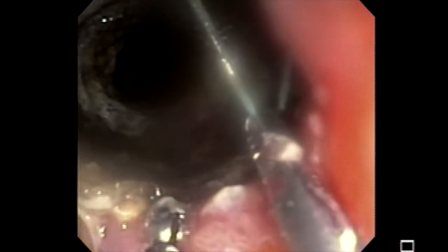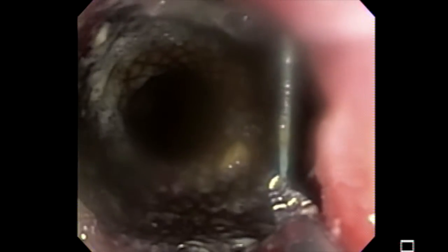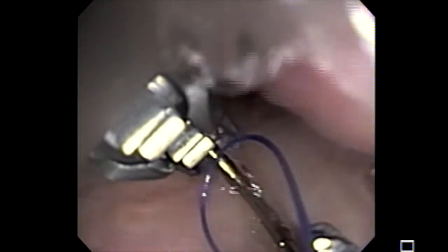I'm trying right now to pull the stent up with Raptor, and it's not working, so I'm going to add a biopsy forceps to the other side. We're using a dual-channel endoscope, and by having a Raptor with biopsy forceps at the same time, it is easier to maneuver the stent up without injuring the tissue or causing any problem. Once we advance the stent up to the desired length, we are going to start the suturing with the overstitch device.